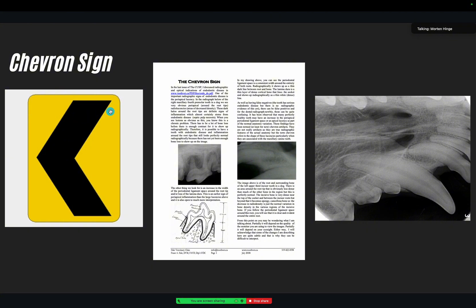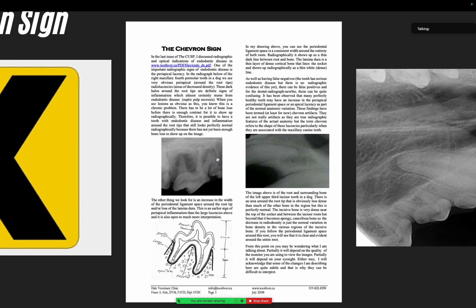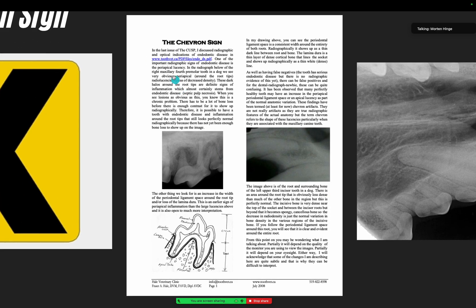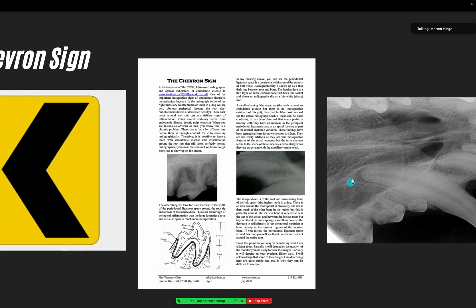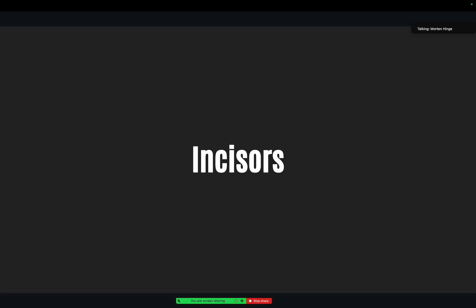There's something called a chevron sign — you see them on the side of the road. There's a very nice paper; you should check out toothvet.ca by Fraser Hale, who has done a lot of nice papers. This discusses what is called the chevron sign — basically, around certain teeth there is a triangular shape of lucency, and this is to be considered normal.